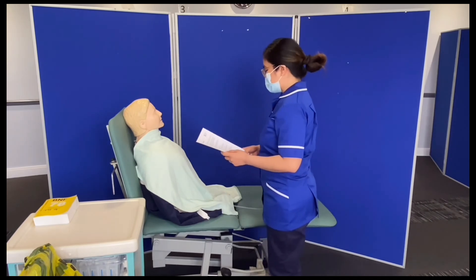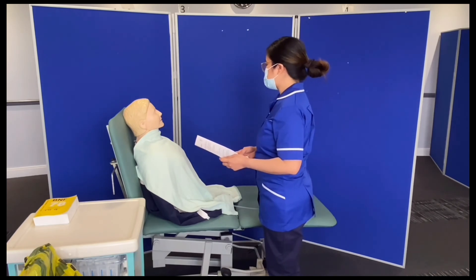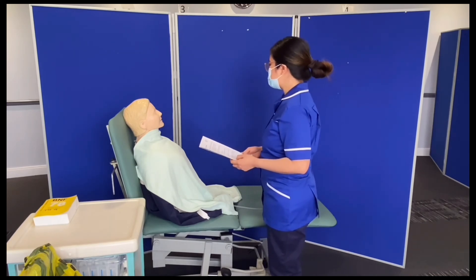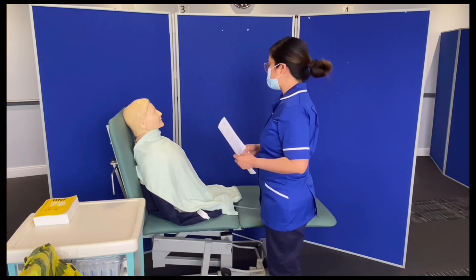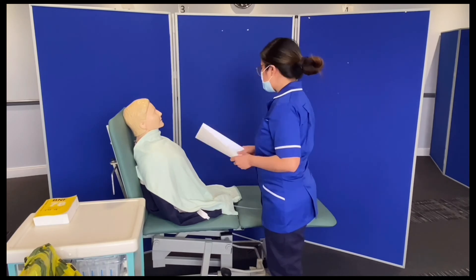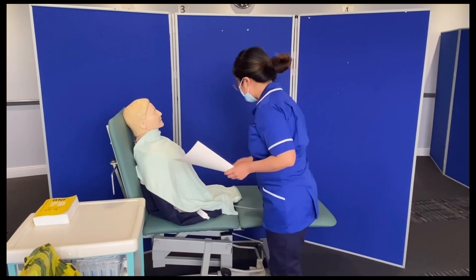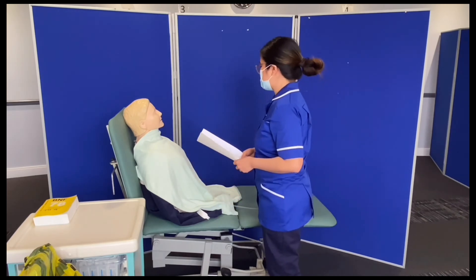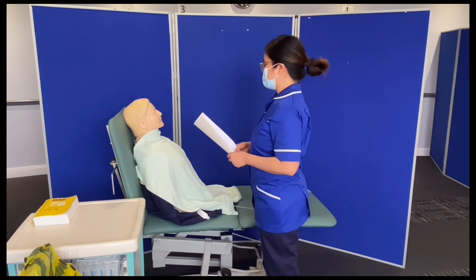Right, that's good to know Jennifer. As I said, I'm here to check your blood sugar level for 2 o'clock as ordered by your doctor. I think you've had that done before as well? Yes. I just have to ensure that the site of the prick is rotated to prevent any skin damage. I'm going to prepare my equipment — I'll give you this call bell, and if you have any concerns while I'm away, press that and someone will be in touch. Is that okay? That's okay.